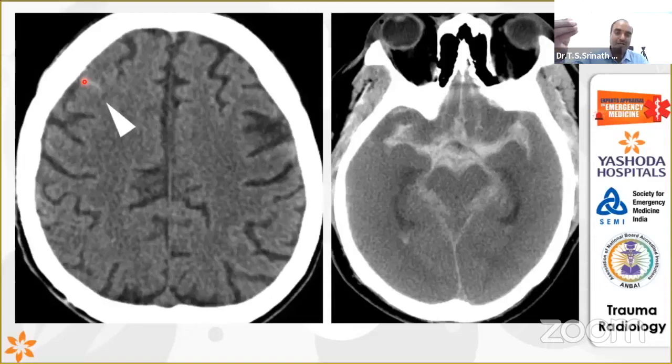For these patients also, based upon the GCS and the clinical signs, you have to again activate your team and say, yes, I have to call for the neurosurgeon and get the surgery done. Only then will the patient be ready enough. So the midline shift plays the key role. Next slide, please. The diagnosis is already put there.